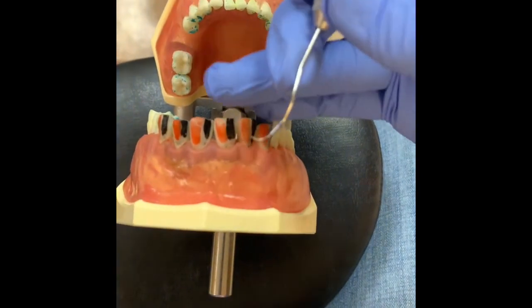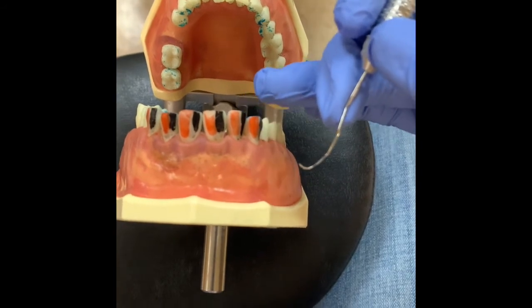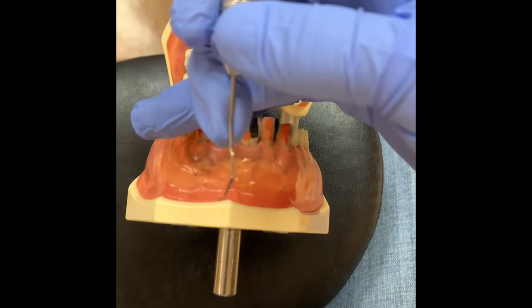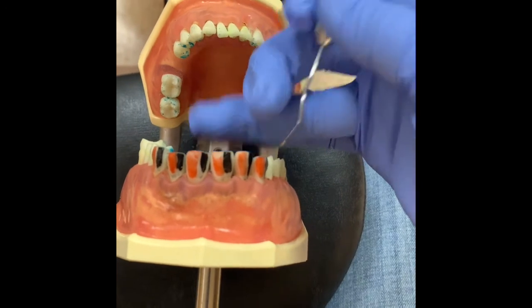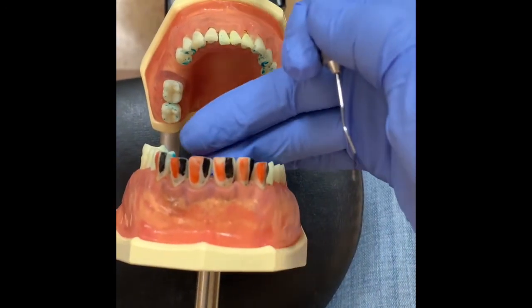Now, when I do 12 o'clock, I would start with the canine that is closest to me. So now I would start with number 6 to number 11 on the facial, 6 lingual to 11 lingual. But I'm staying at 12 o'clock for my surfaces away. And on the lingual aspect, I'm going to use my mirror.